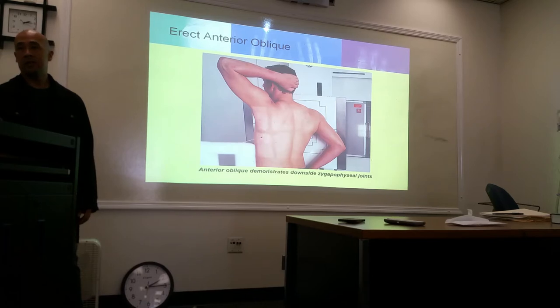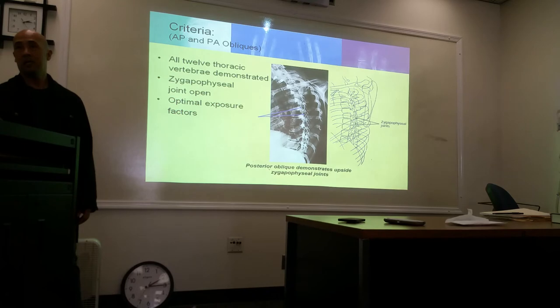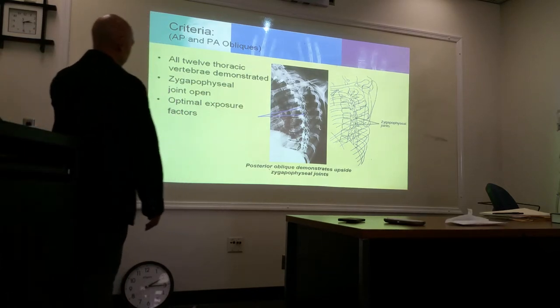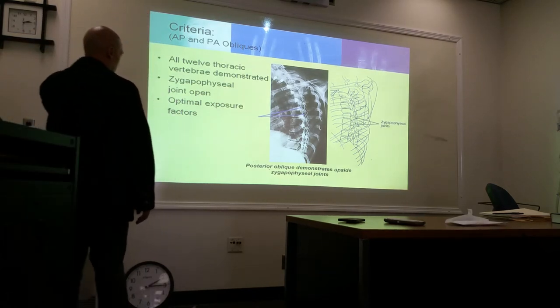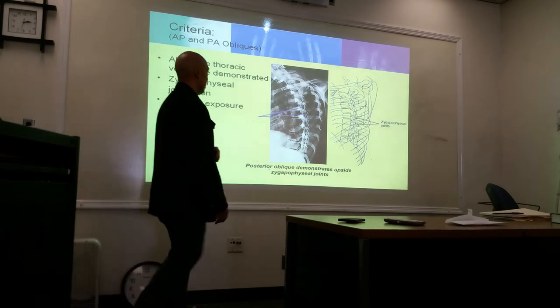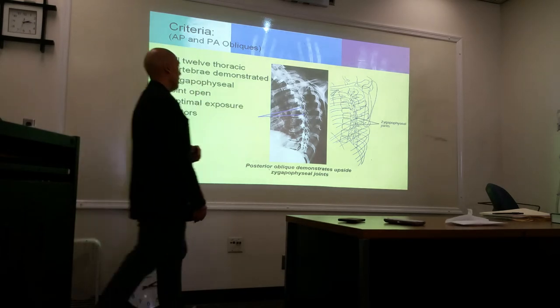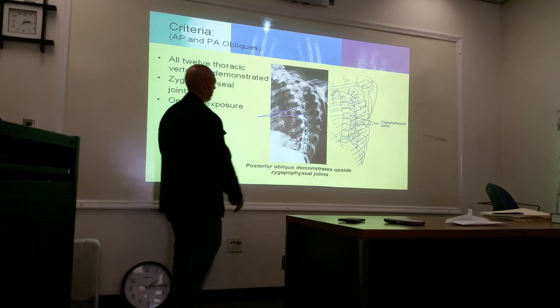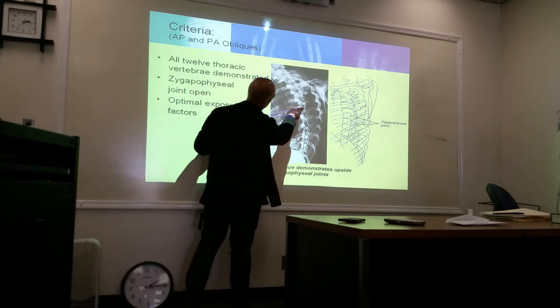Anterior oblique demonstrates the side closest to. All 12 thoracic vertebrae should be demonstrated. The zygapophyseal joints should be open — very difficult to see, but there they are.